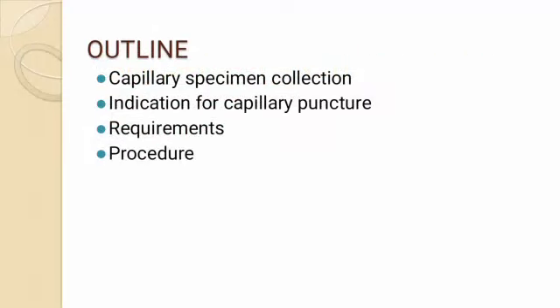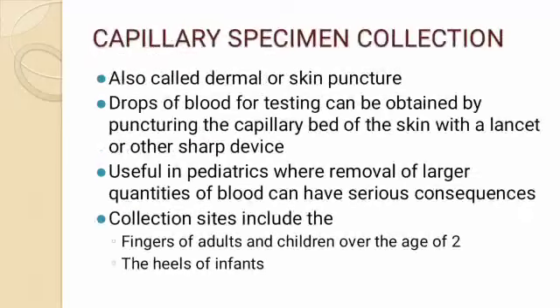Outline. The outline of my presentation is capillary specimen collection, indication for capillary puncture, requirements and procedure. Capillary specimen collection, also called dermal or skin puncture. A drop of blood for testing can be obtained by puncturing the capillary bed of the skin with a lancet or other sharp device. Useful in pediatrics where removal of larger quantities of blood can have serious consequences.